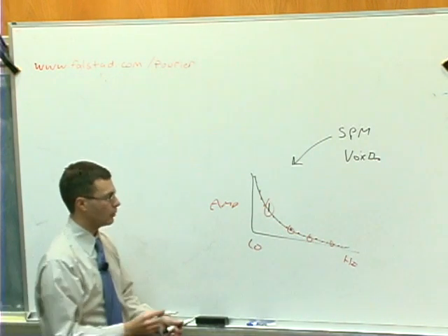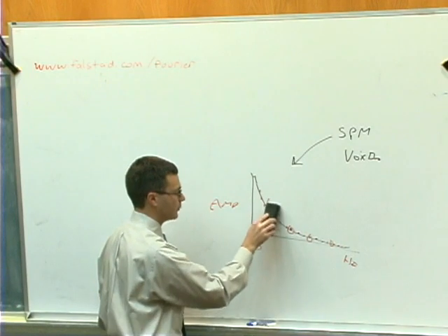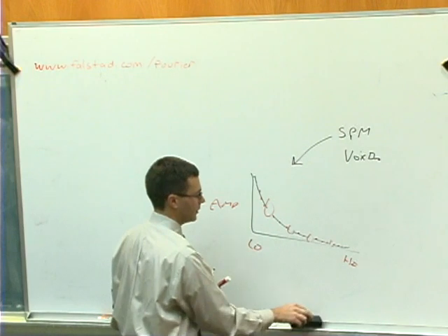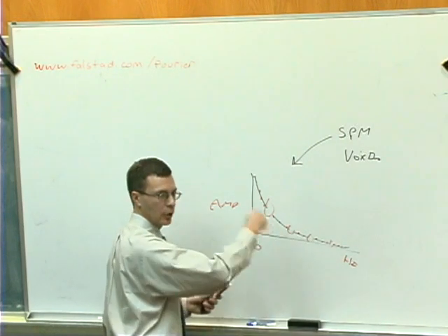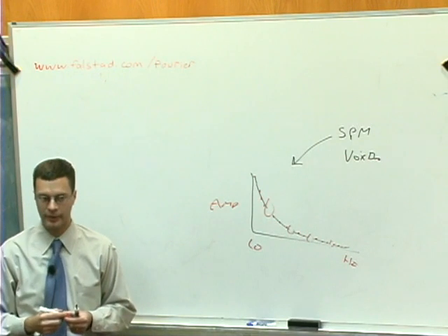Okay. So what we do then, just for modeling purposes, is we say, okay, ignore these frequencies. Fit a curve, but ignore the frequencies at which there was a task, so that we can fit the curve that was there, unmodified by the presence of experimental variance.